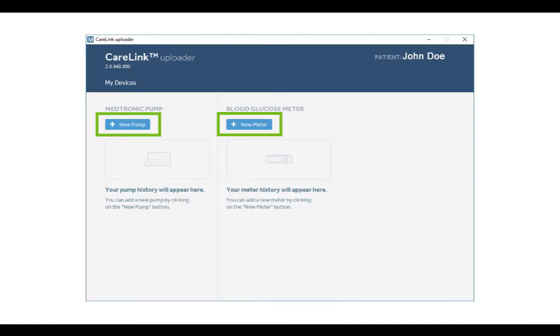On the first screen, select Add Device for each pump or meter you wish to upload. You only need to do this once for each device.